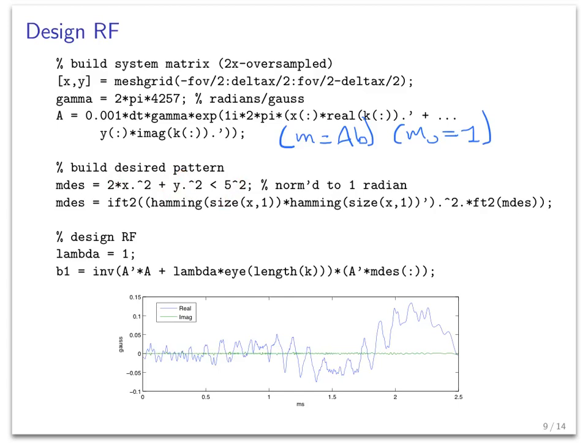So I'm going to smooth it by taking its Fourier transform, and then I'm going to multiply it by a 2D Hamming filter that I've also squared just to increase the smoothing a little bit more. So this is a k-space filter. What I do there is I build one Hamming vector of a Hamming window, build another identical vector, and I take their matrix outer product, right?